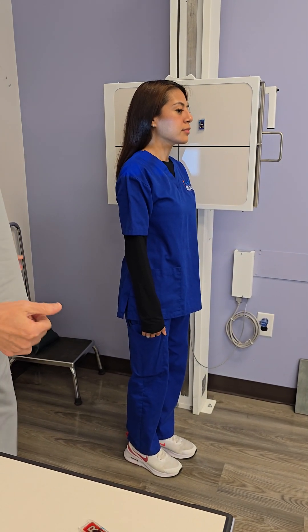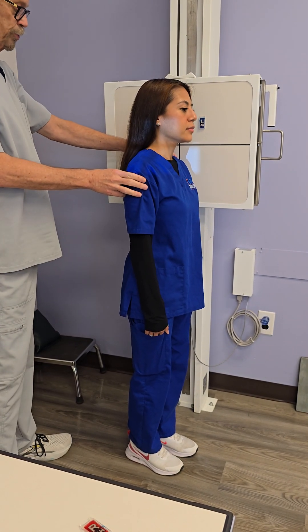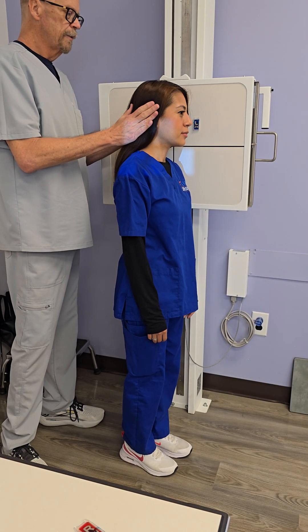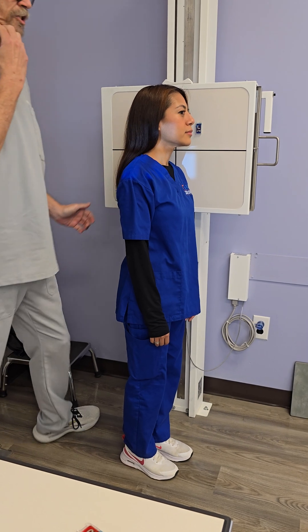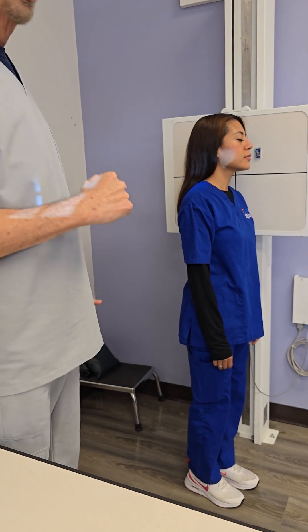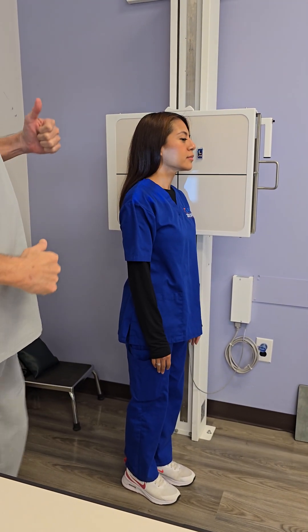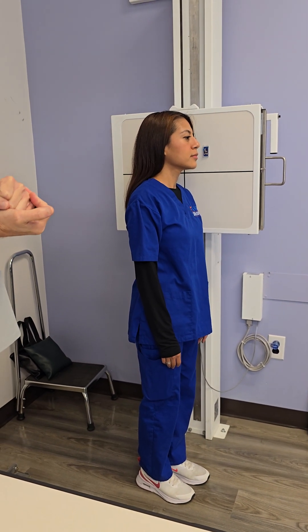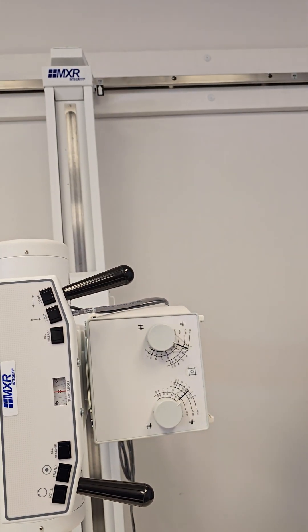We want to be able to see all seven vertebral bodies — C1 through C7. Relax your shoulders. Look straight ahead and bring your chin up just a little. We want to raise the chin so the mandible doesn't superimpose over C1. You're going to hold your breath, don't move, and we're going to take that first exposure at a 72-inch SID.